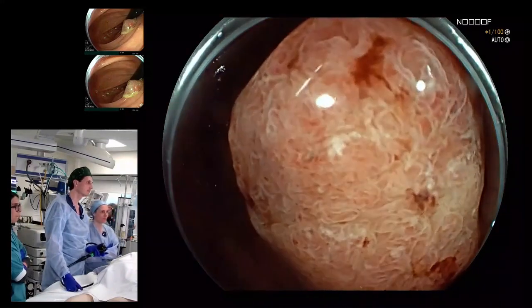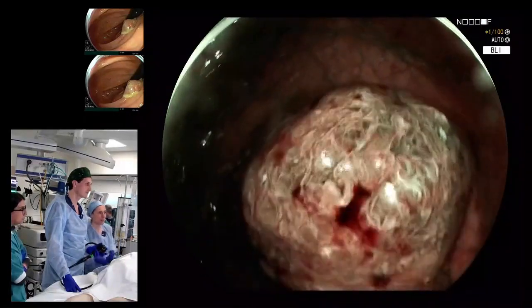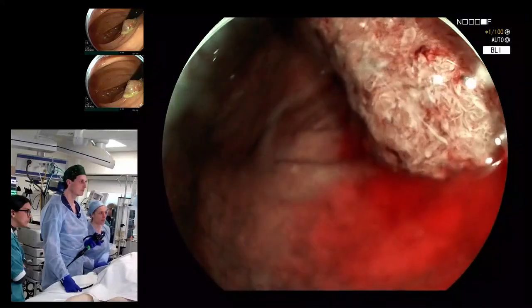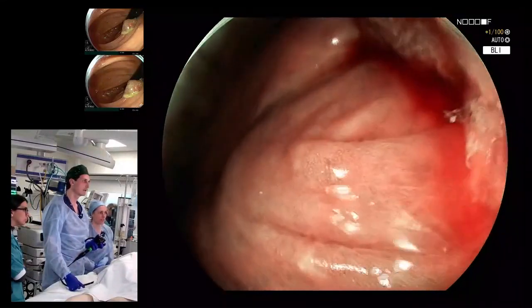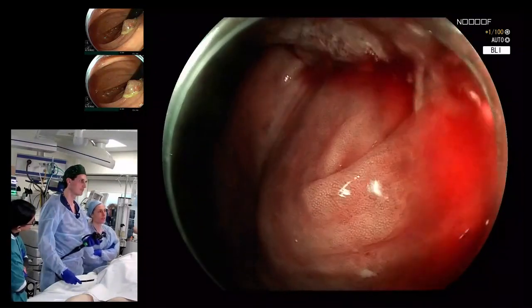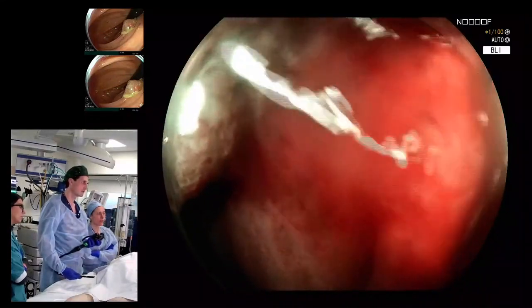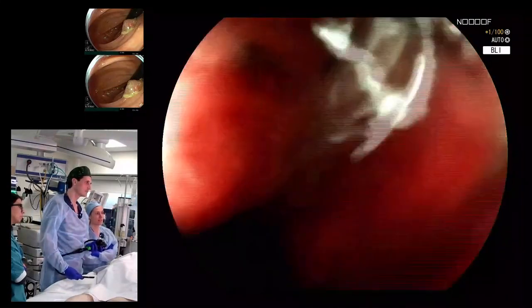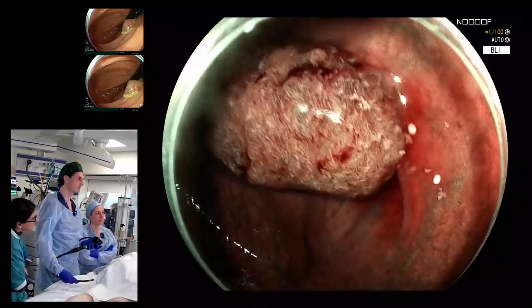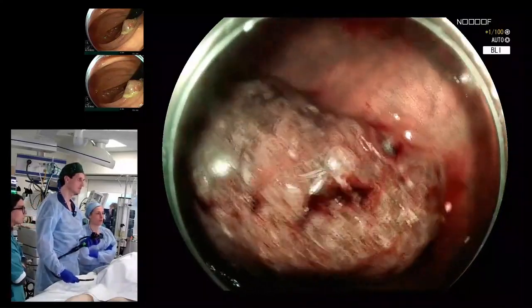Yes. So I'll turn on, maybe just the landmarks. PJ already told me though the appendiceal orifice is not involved, just right next to it. Yeah. Very important when you want to start an EMR is really knowing where your orifice lies. Really be sure that it's not involving the orifice, or if it is, you might consider different techniques out of the scope for today, I think. Also not close to the ICV. No, also not.